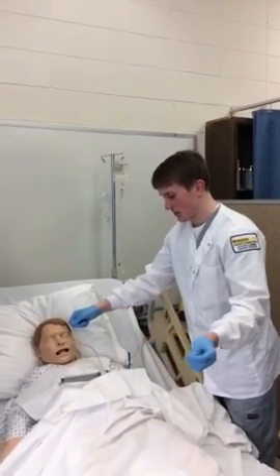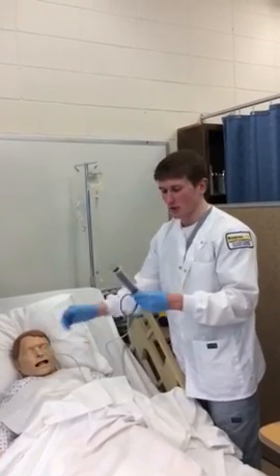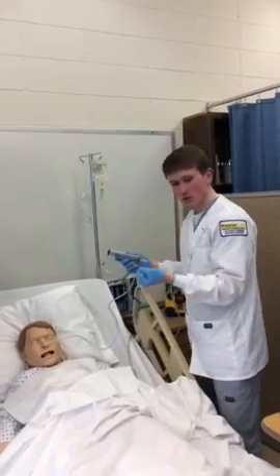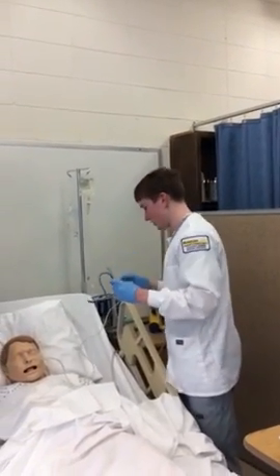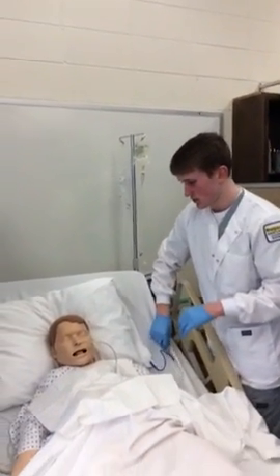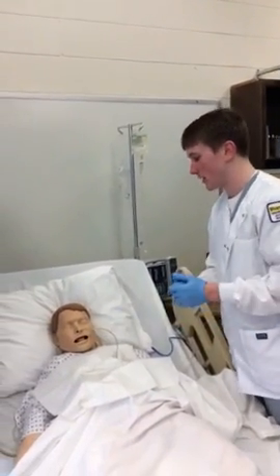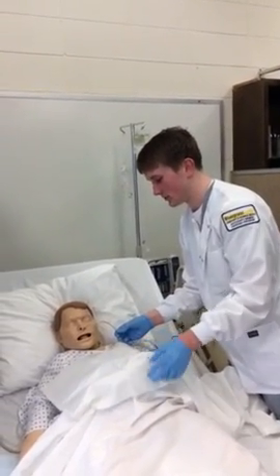And now once I've done that, I'm going to clamp the tube, remove my syringe, and then either cap the line or connect it to suction. And once I've done that, I can provide oral care with any swabs I have handy. Right now, for the purpose of this video, I don't have any, but provide oral care, and then clip the tube to the patient's gown.